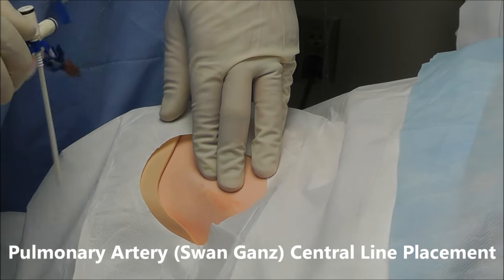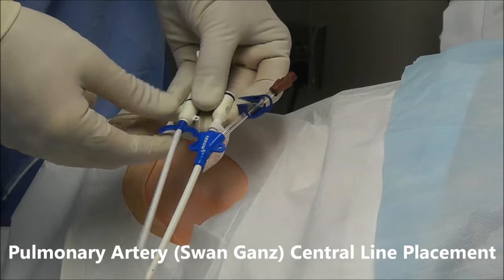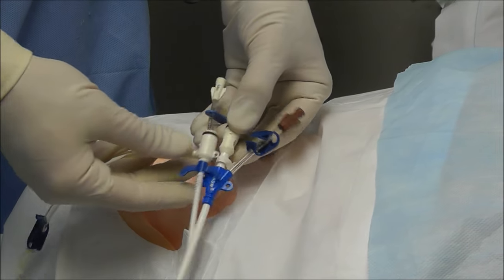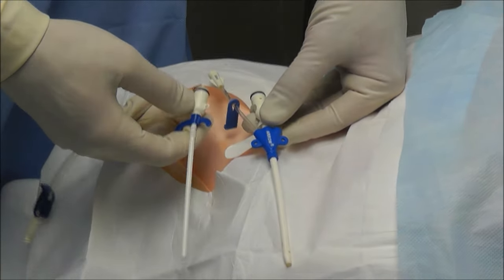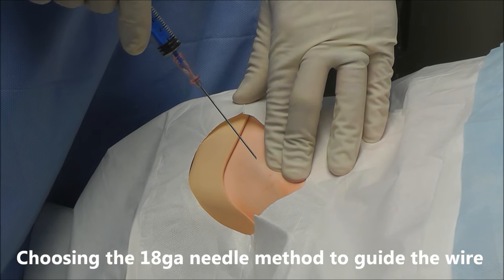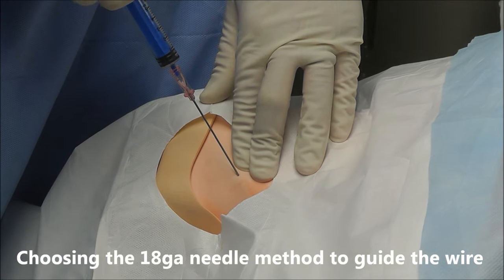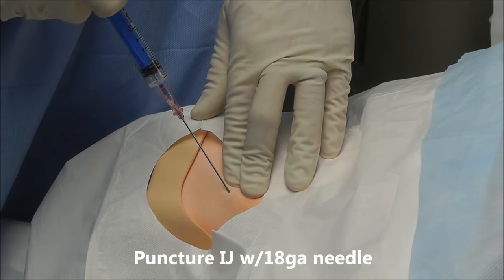For this type of central line, I'm going to float a pulmonary artery catheter. So I'm going to need a type of central catheter that has an introducer port, right there and right there. I've already found the IJ with my finder needle, so I'm just going to go in through that same spot and hold negative pressure here.